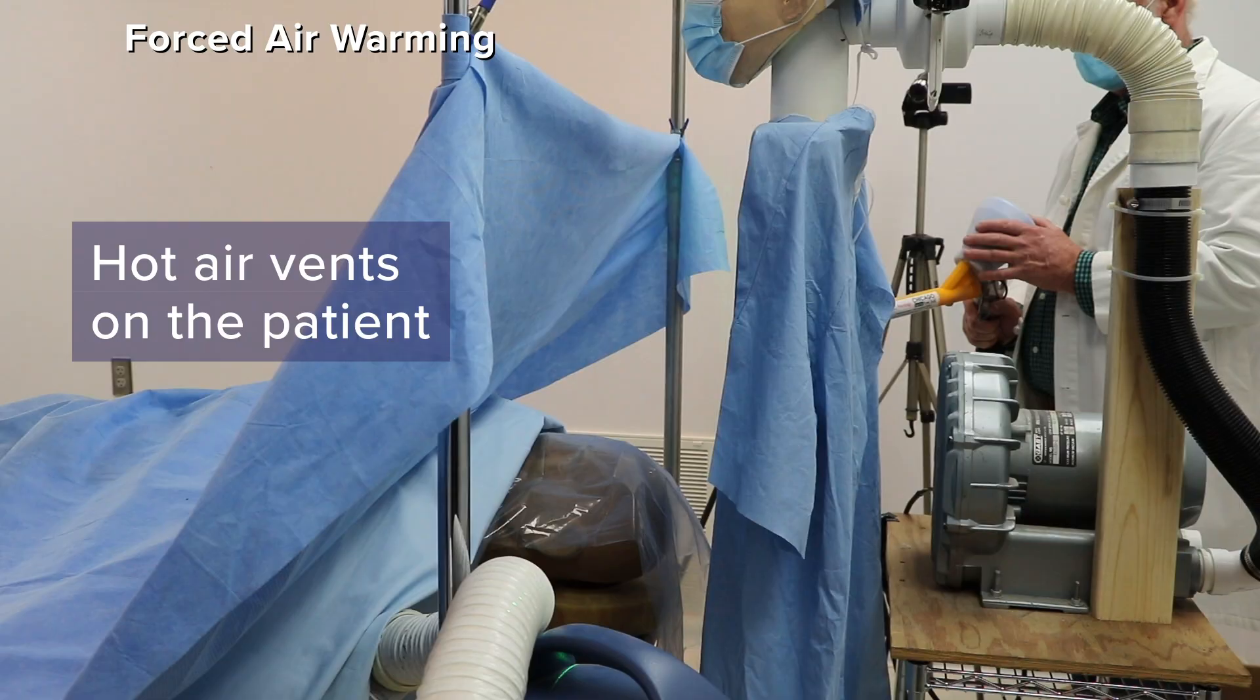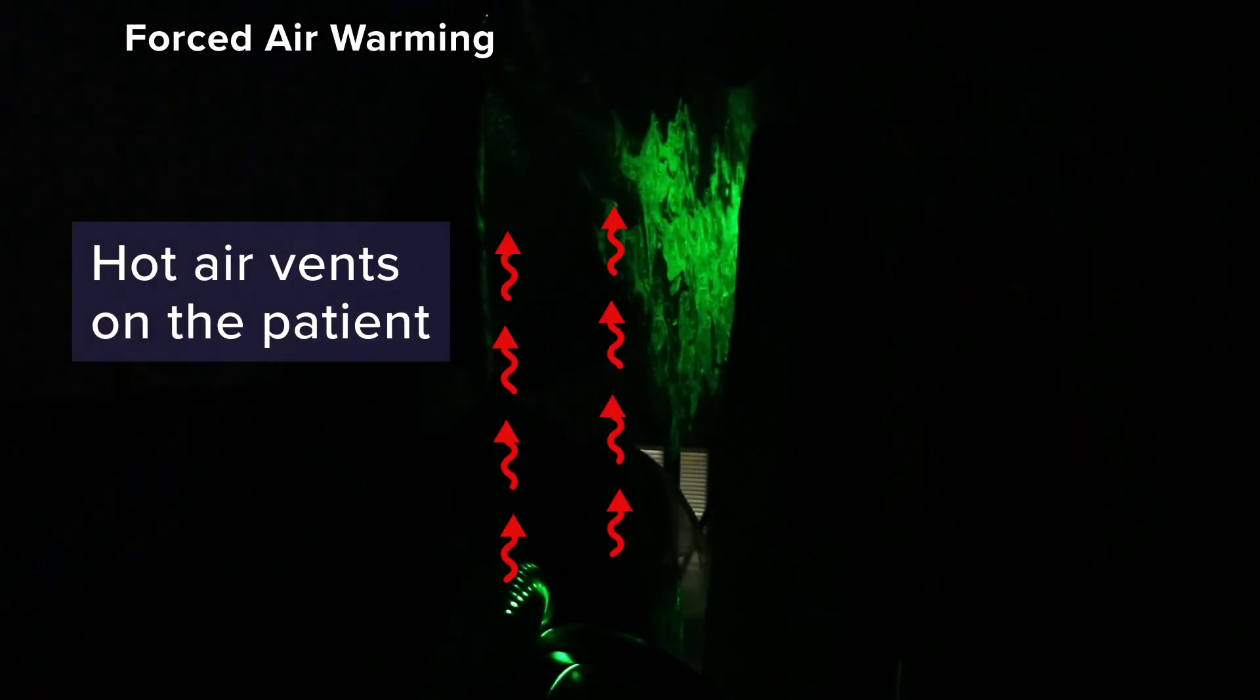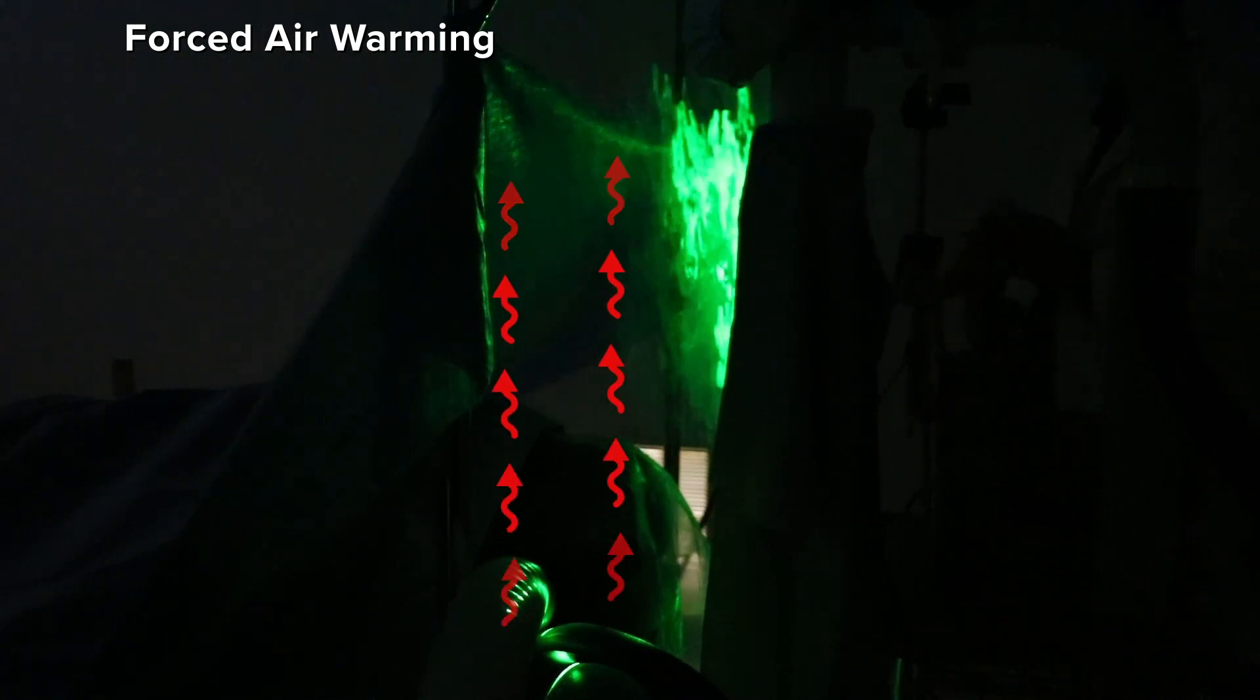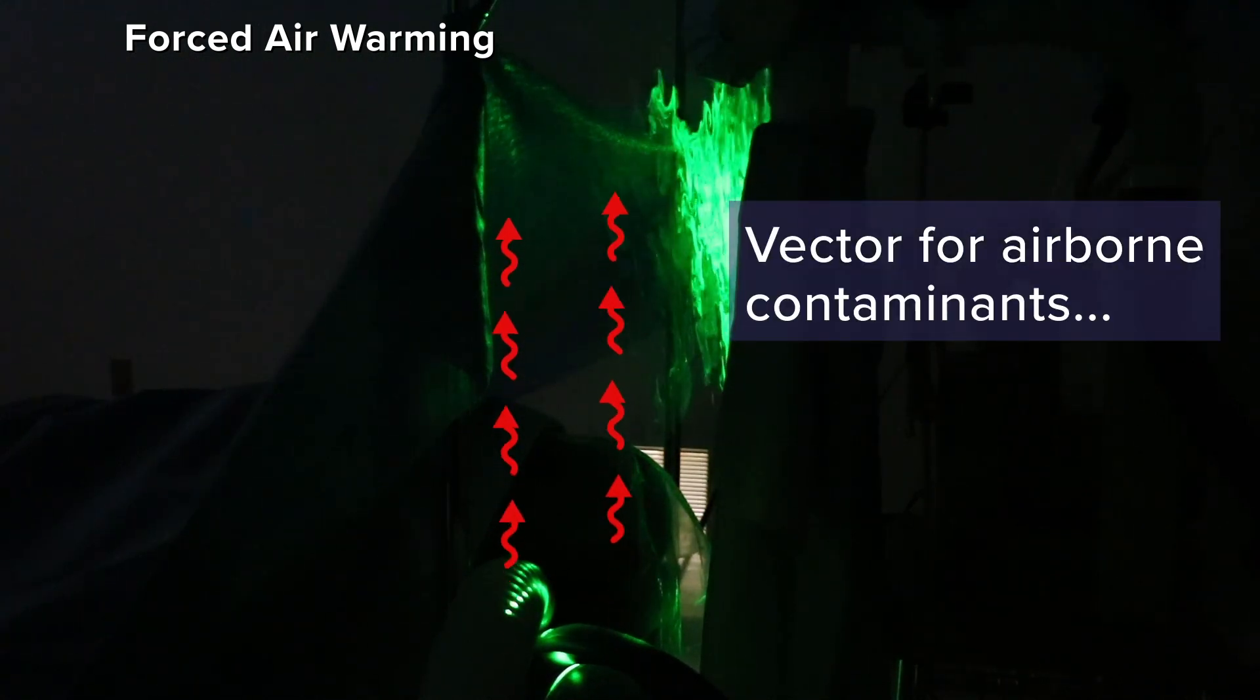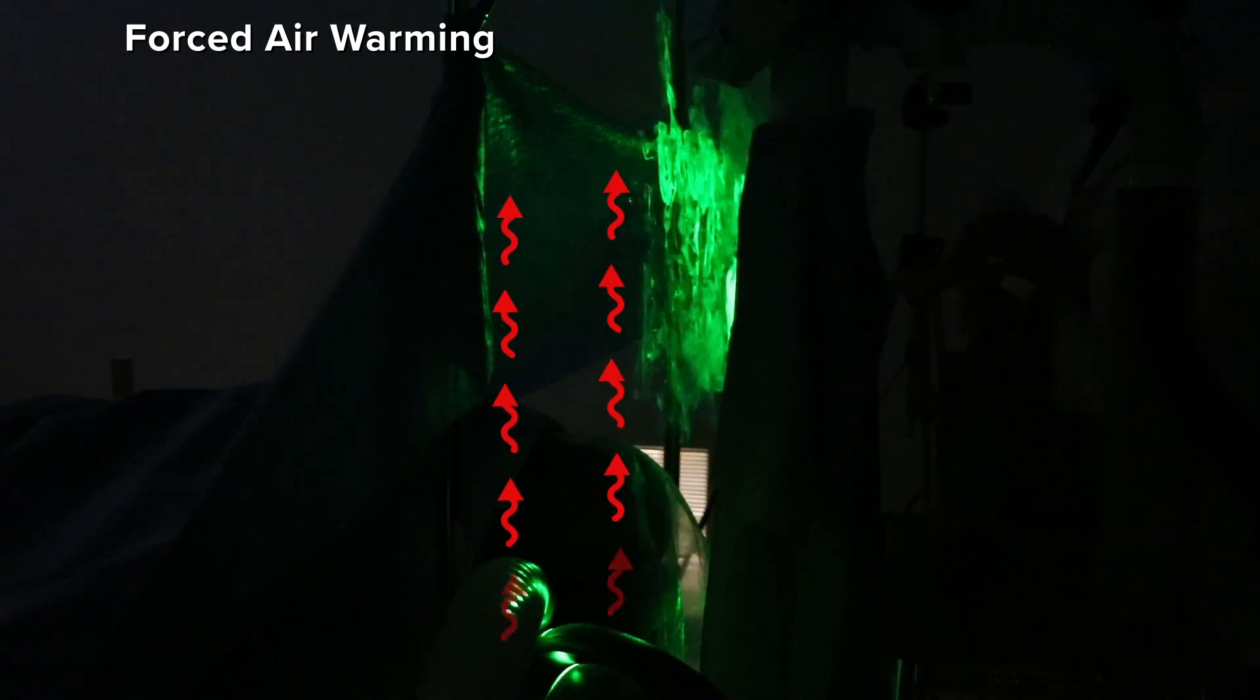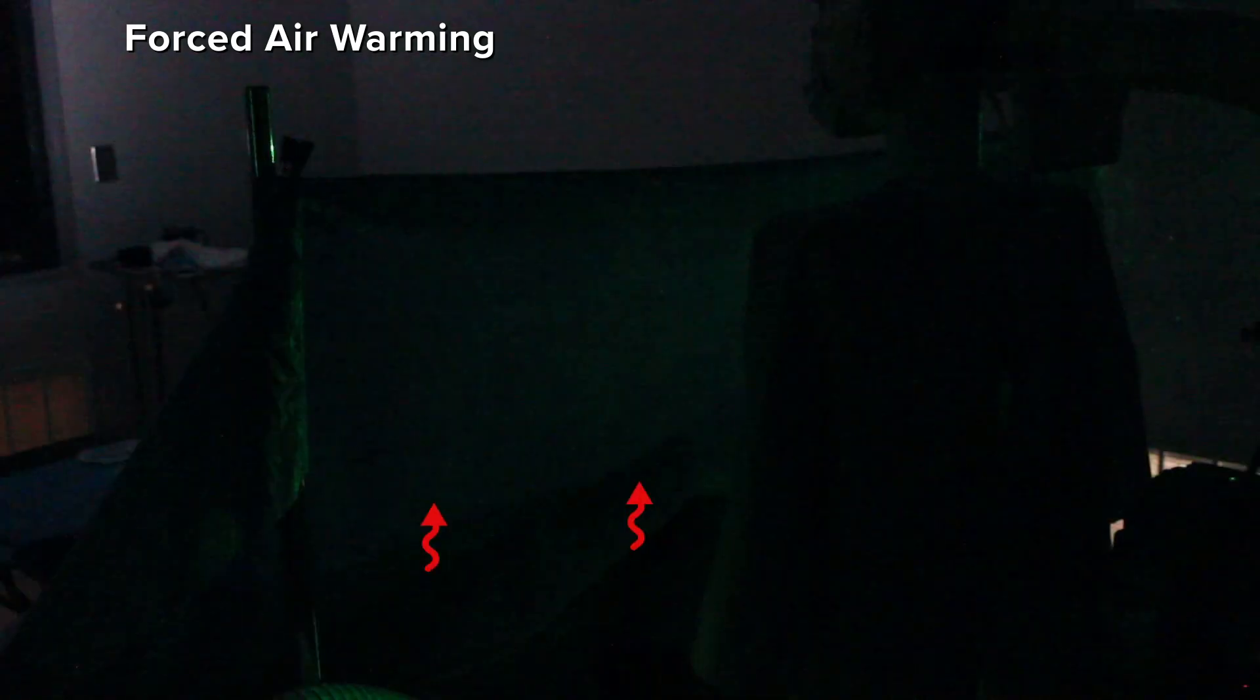Forced air warming systems blow hot air to warm the patient. The hot air is vented under the blanket, escapes, and rises along the anesthesia drape. The rising waste heat transports airborne contaminants, including bacteria and viruses, from contaminated areas.